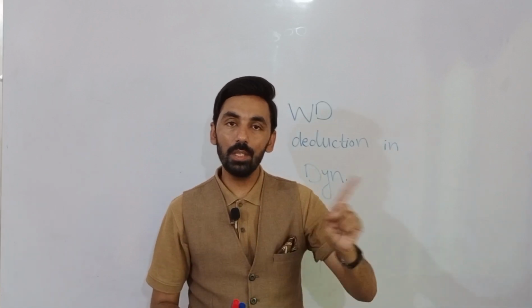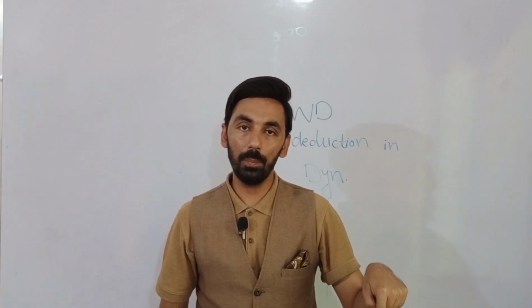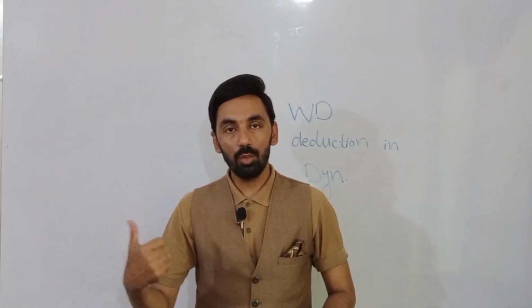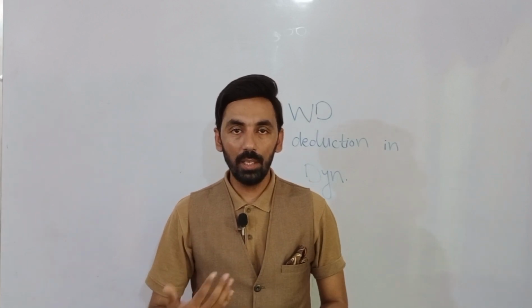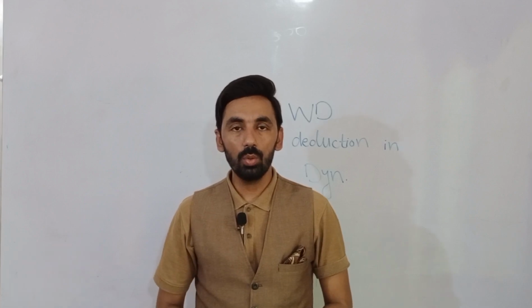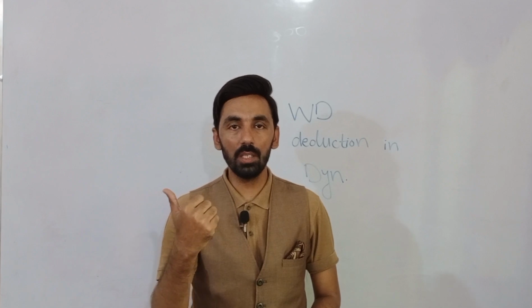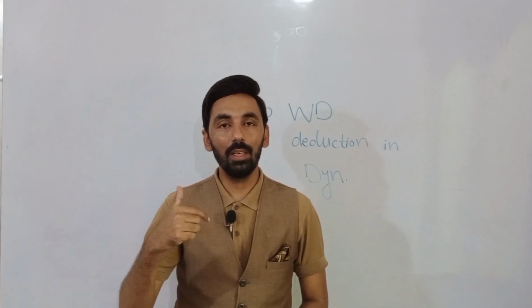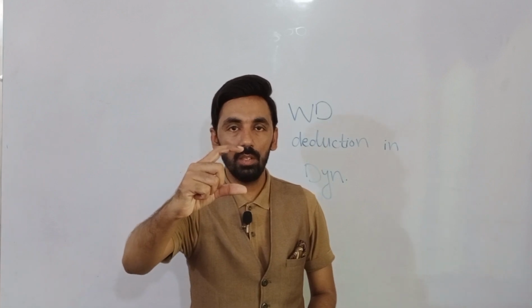So distance should not be deducted from the neutral points in dynamic retinoscopy. In static retinoscopy, we are going to correct astigmatism, hypermetropia or myopia, so we have to deduct the working distance because we are going to wear our glasses at this distance, not at that distance.